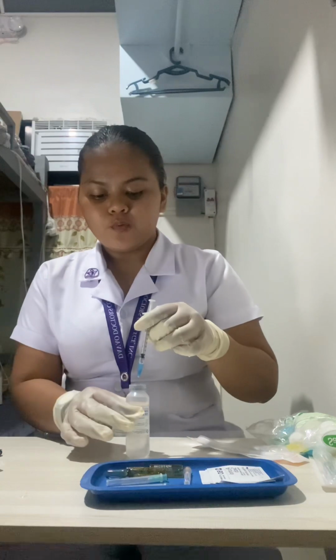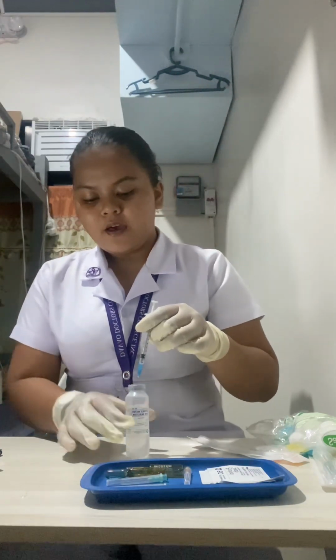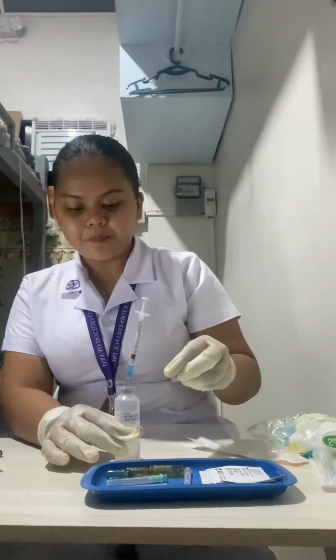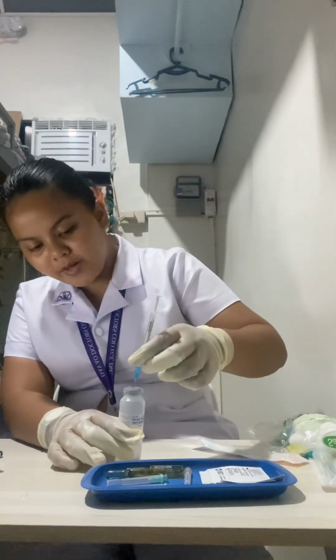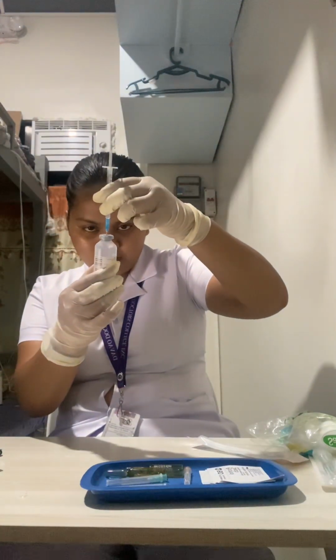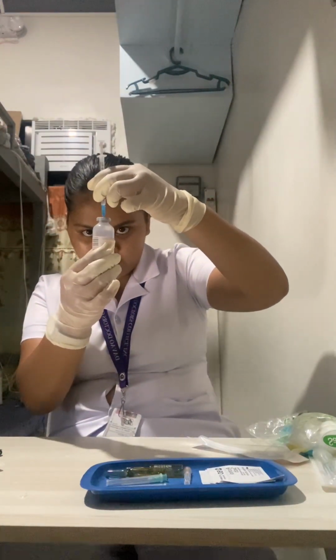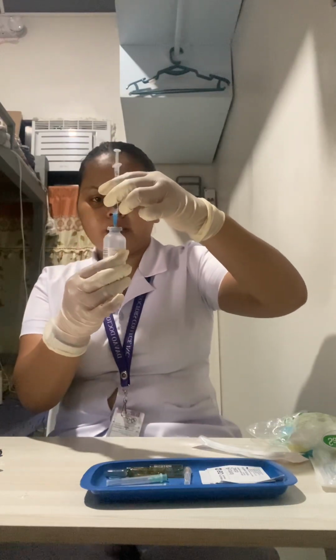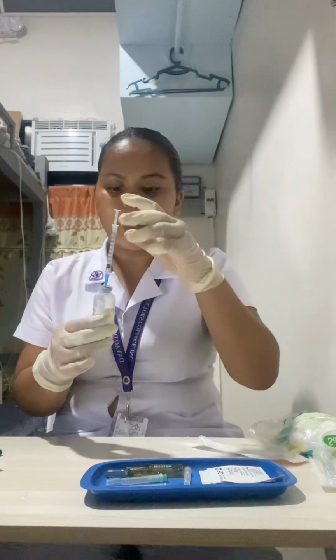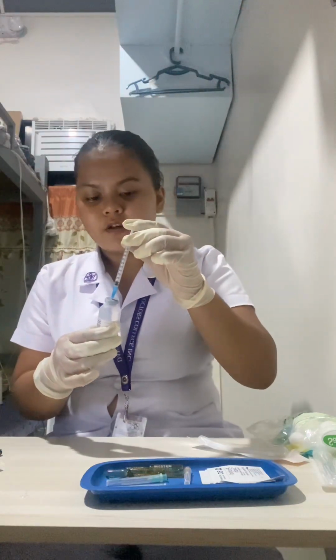In withdrawing the medication, we have two methods. The first method is putting the vial flat on the surface, making sure that the base is lower than the top, and then moving the bevel a little bit so that it touches below the surface. This is to prevent withdrawing air or having air present in the syringe.